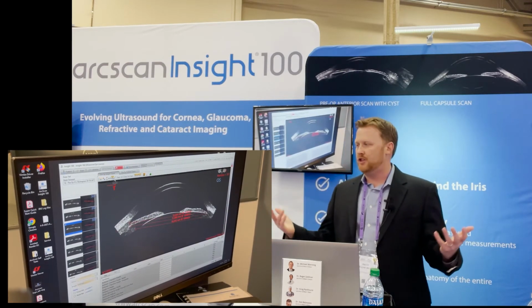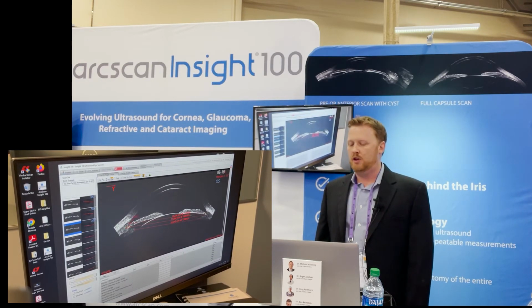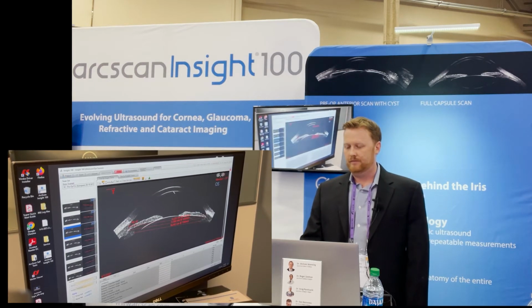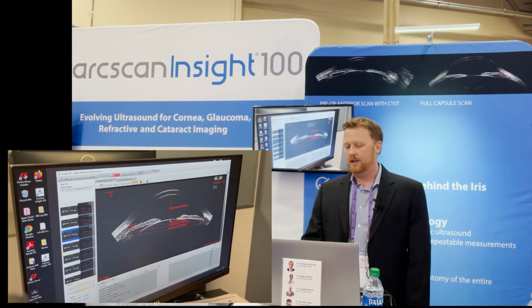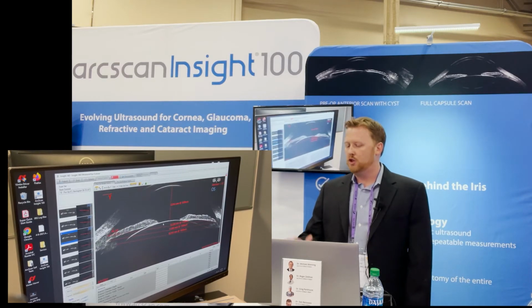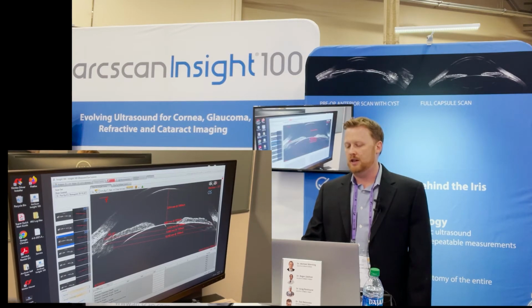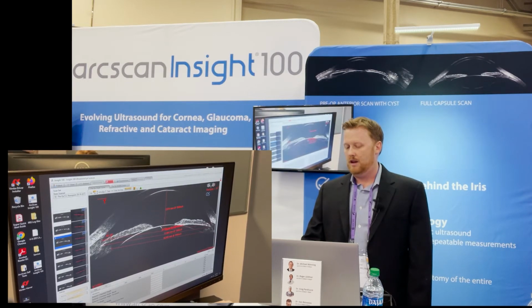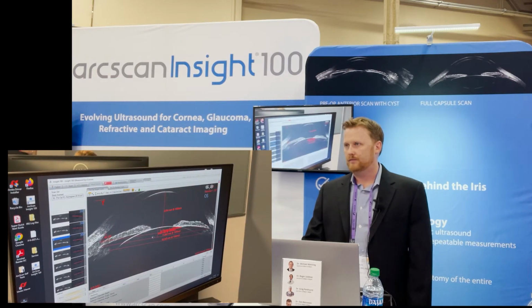And as the physician, you can train one of your technicians to be able to do these measurements for you as well. So you don't have to be the one that's doing it either. So getting a good anterior chamber depth, getting the angle. And you can zoom in to get even more precise measurements, which is very nice with this technology. And then you can get the lens rise from the sulcus. No, that one's the sulcus, and that was from the angle to angle. Yep.